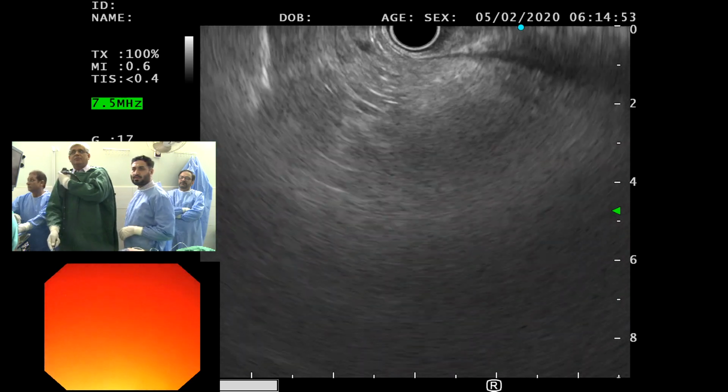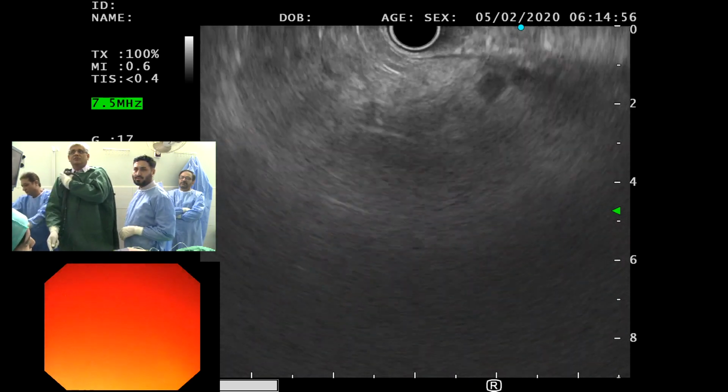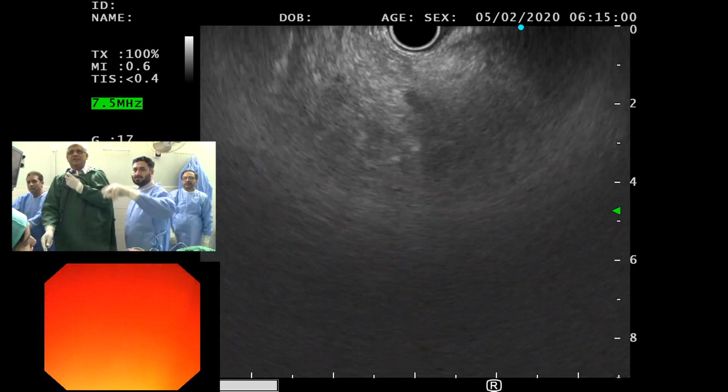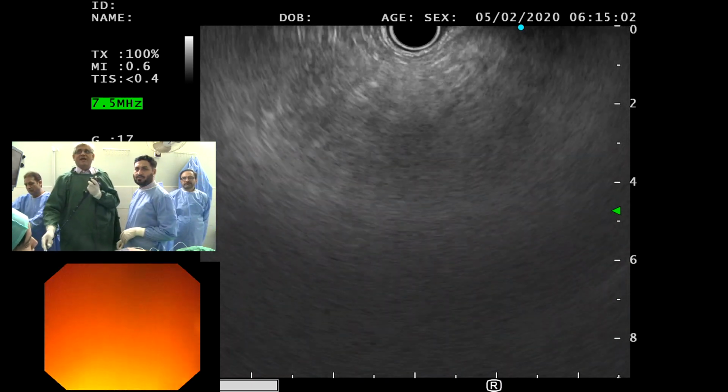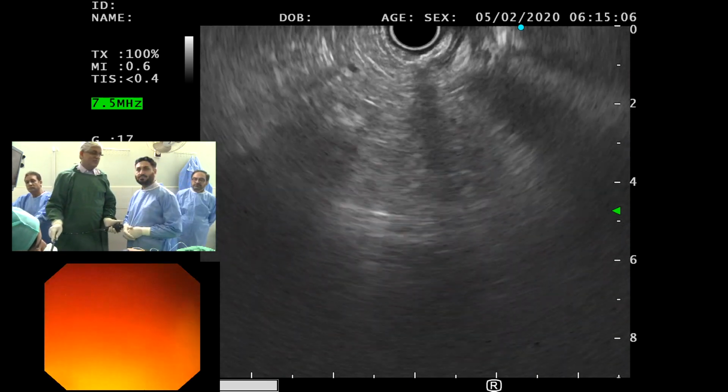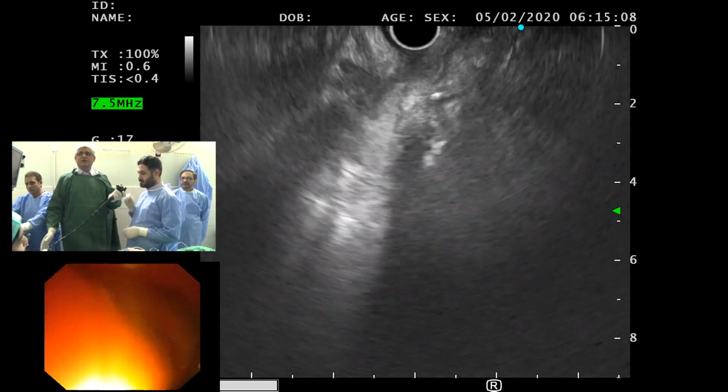So your tip up is important. There you got the spleen. Okay. This is a big subject, so sometimes you can't see things as clear, and you just saw the adrenal as well. Our area of interest here is D1. So let's go to D1.